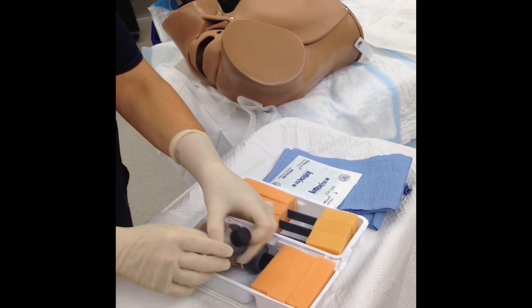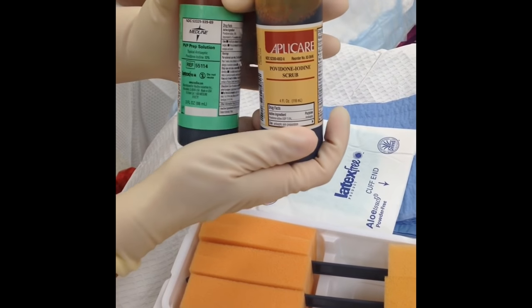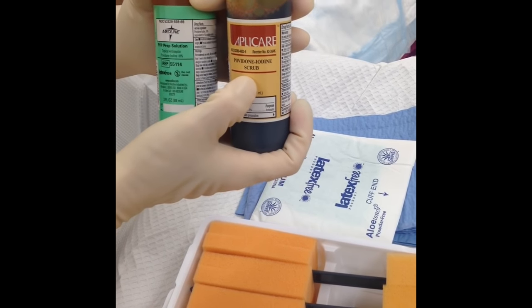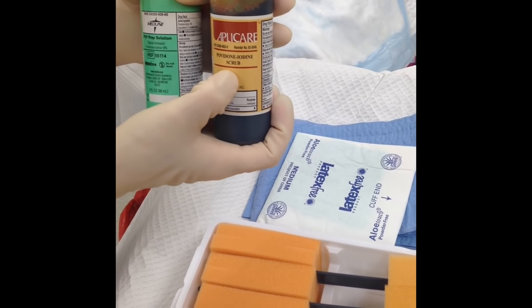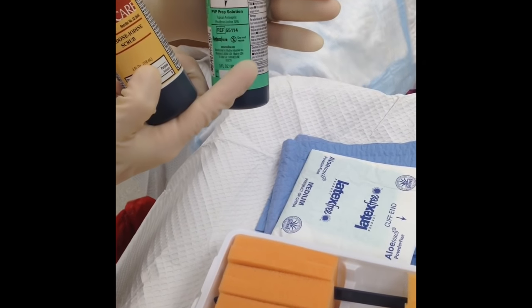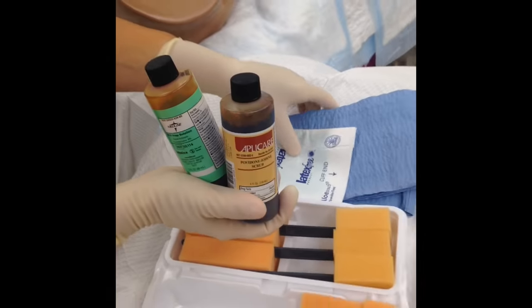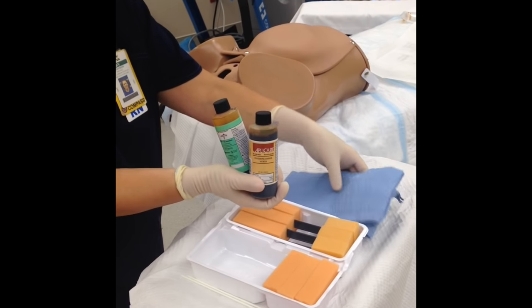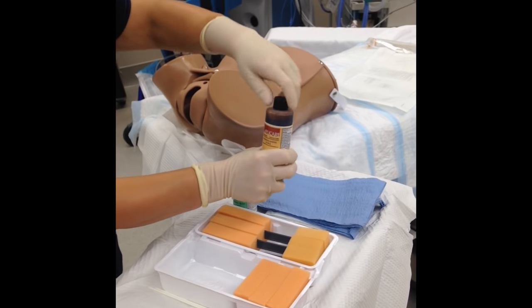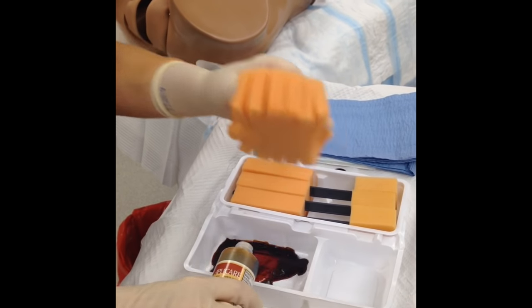Inside the kit we have scrub and solution. Your scrub has a soap in it that's only appropriate for the outside and not appropriate for mucous membranes. So your solution is what's going to be used internally inside the vagina. These blue things are your blotting material used in between these two steps.